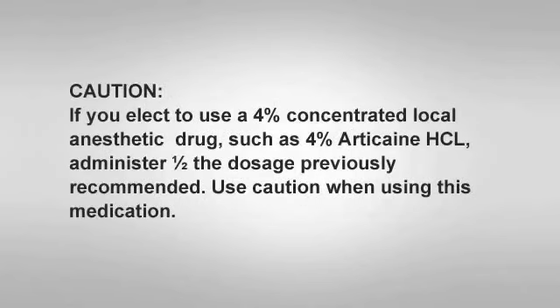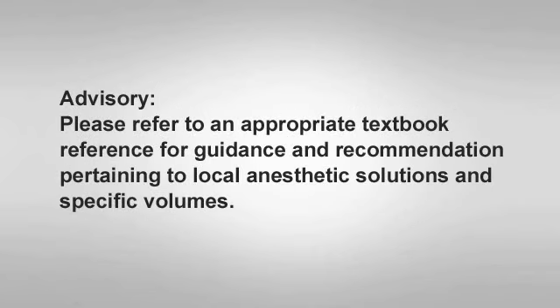If you elect to use a 4% concentrated local anesthetic drug, such as 4% articaine HCl, use 1/2 the dosage previously suggested and use extreme caution when using these medications. Please refer to an appropriate textbook reference source for guidance and recommendations pertaining to local anesthetic solutions and specific volumes. You will find that using the STA system, using the STA wand handpiece and bi-rotational insertion technique will allow you to deliver a more comfortable mandibular block with a greater success rate and a shorter onset of anesthesia.